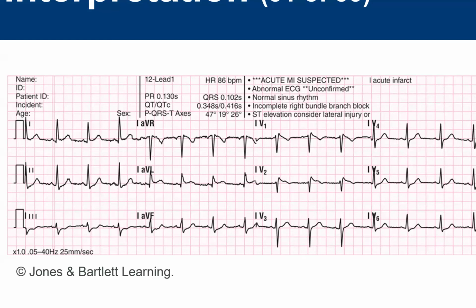We determine the underlying rhythm, whether we had a 3 lead and we did it on 3 lead, or we went straight to a 12 lead, I don't care. We determine the underlying rhythm. We just did that. Next thing we do is go to V1 and look at our QRS width, or QRS duration. It tells you right here, our QRS is 0.1, less than 0.12. We agree? Narrow QRS. We're not in a bundle branch.